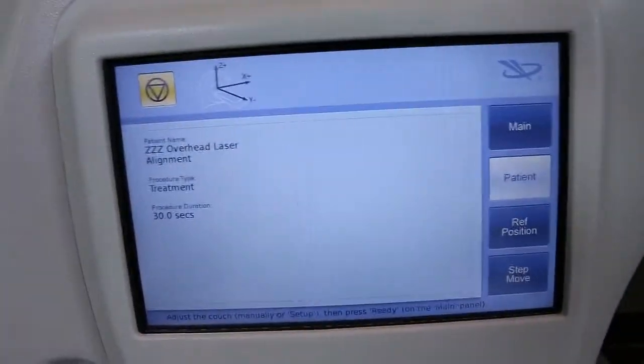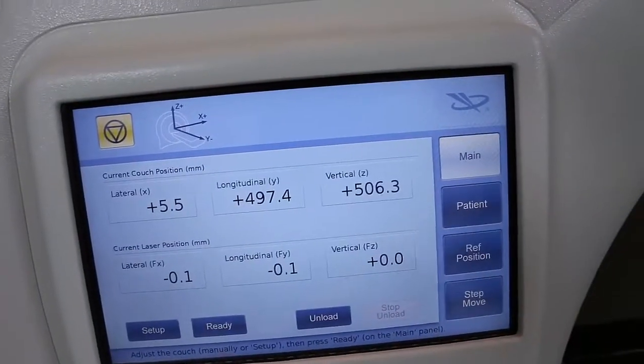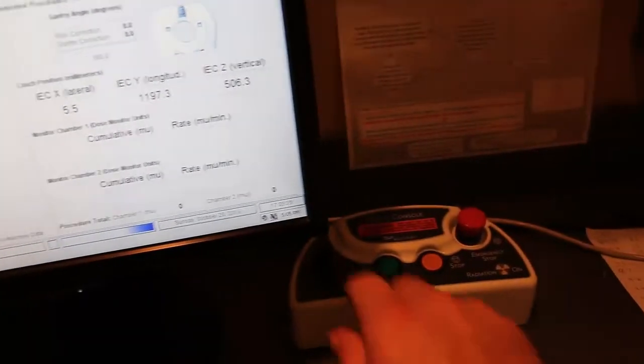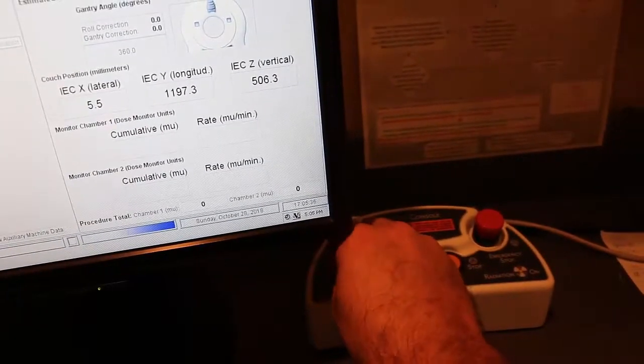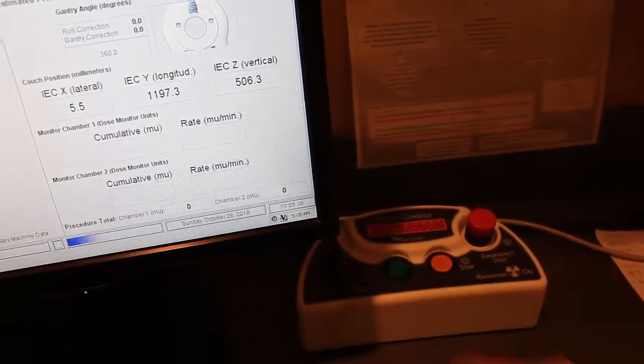Back inside the machine we are going to hit main ready and yes. That will move the phantom inside the bore and back outside at the OS we can turn the key to treat and push start.